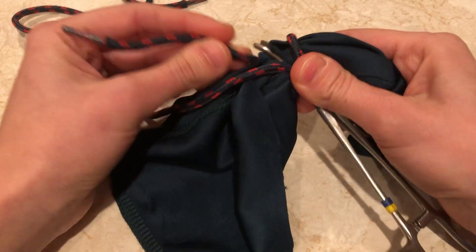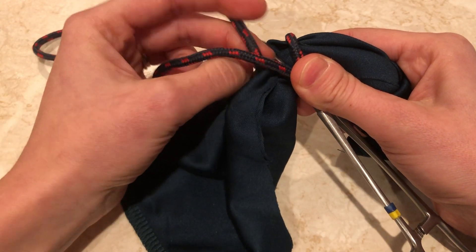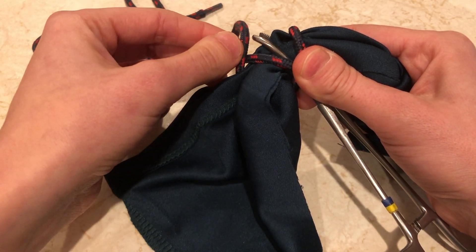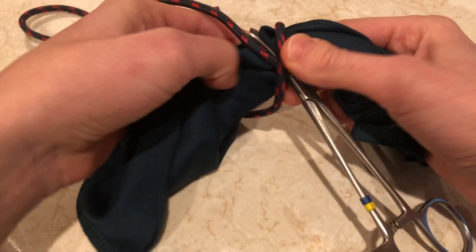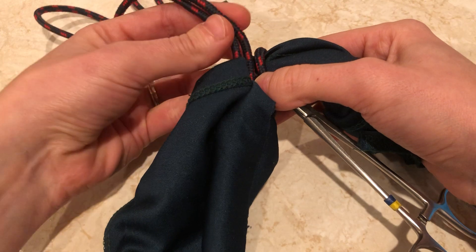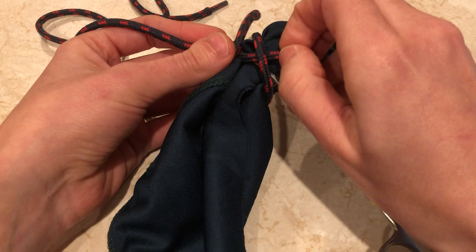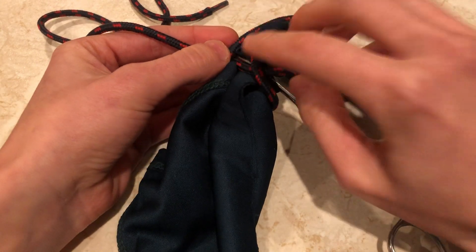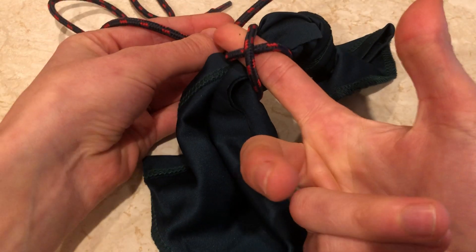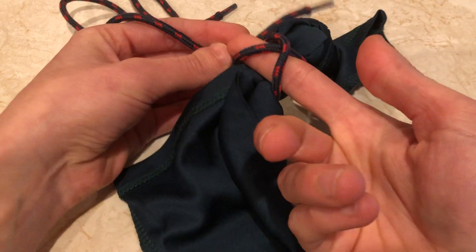Then it comes across on the opposite side — so on the other side of the haemostats — and this is the key bit: it's got to nip in front of the needle edge. So it's gone across, done that knot, come out in front and then flipped like that. And that's when with your needle holders you'll go in straight through this cross like this, parallel to your haemostats. You can see the haemostats just underneath as you go through with your needle holders.